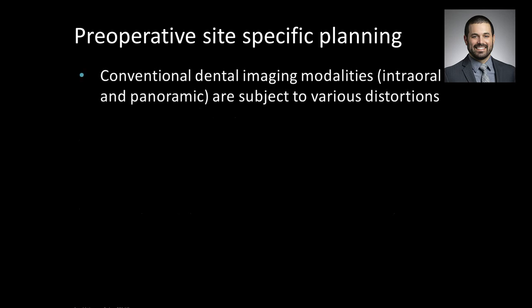And so if we look at our conventional options, our 2D intraoral and panoramic choices are subject to quite a bit of distortion. So I'm just going to revisit this quickly here, and we'll compare that to cone beam CT, which is really pretty accurate.